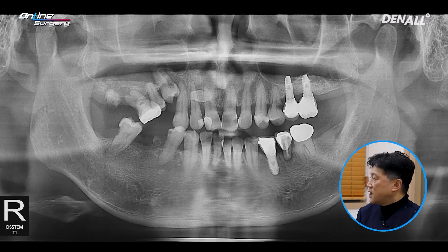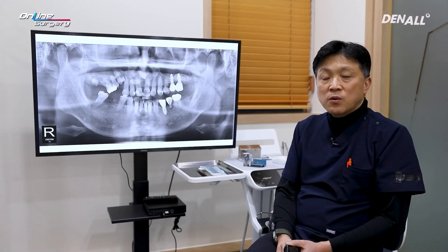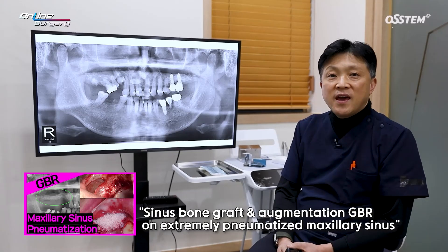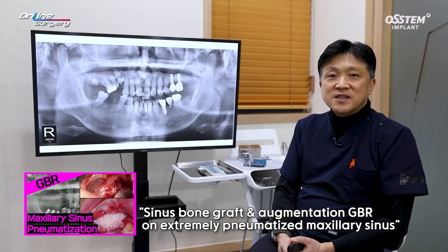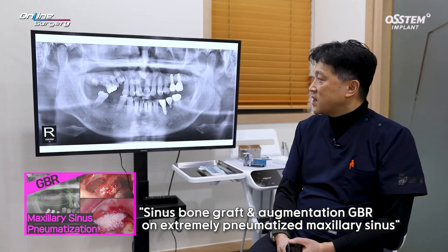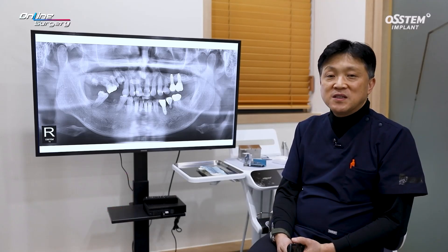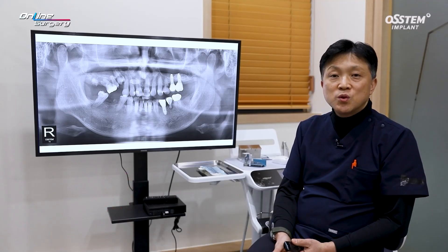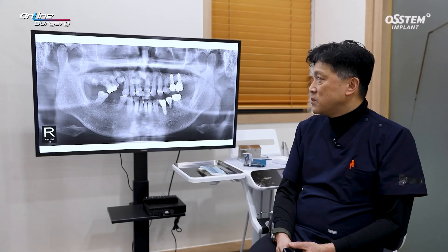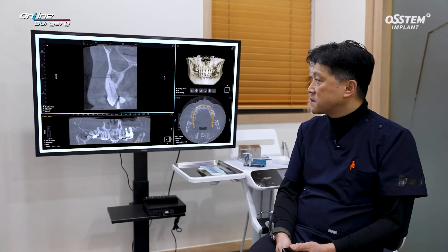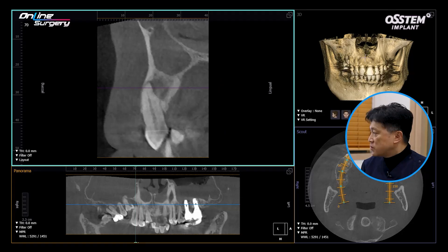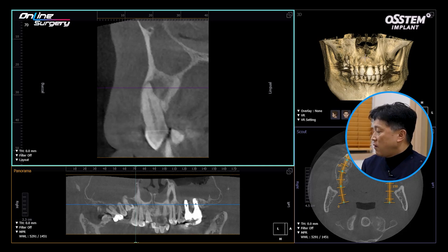This patient was introduced previously through online surgery. If you look at the timetable of the treatment process, we can see what kind of treatment the patient has received. This is the pre-op CT. As you can see, there is very severe sinus haziness.